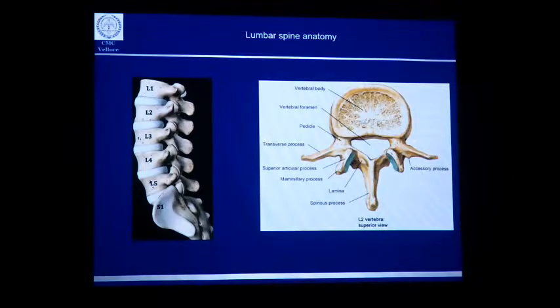And if you want to place a pedicle screw safely, you can see that this is the joint line, and the screw should be placed lateral to the superior articular facet and then directed medially. So the important landmark here is the superior articular facet, to identify it and stay lateral to it for a safe placement of a lumbar pedicle screw.